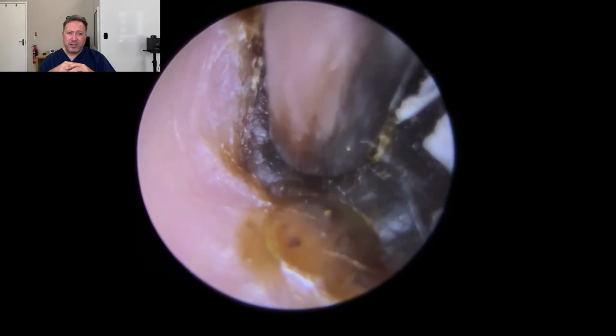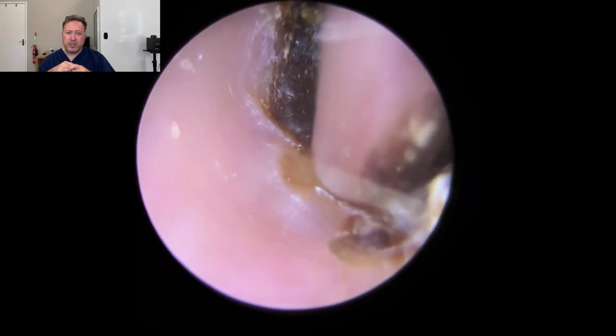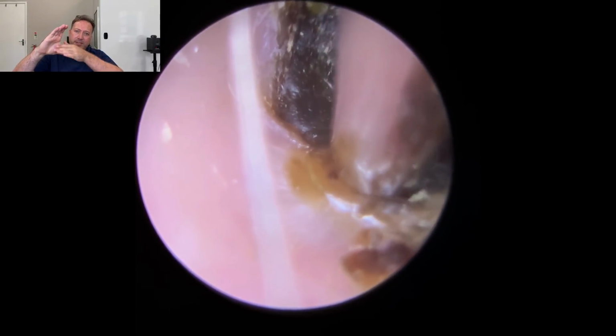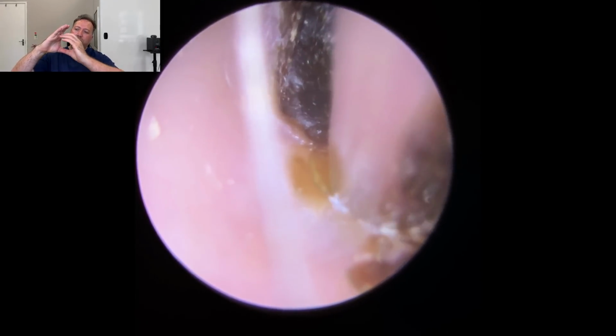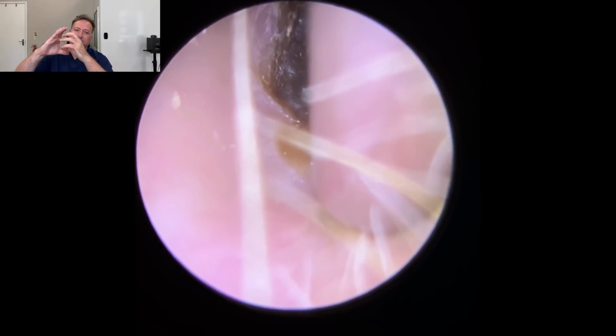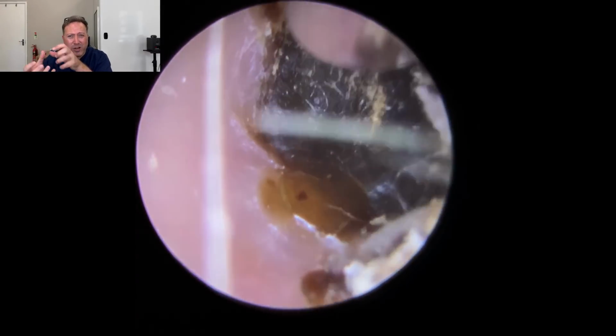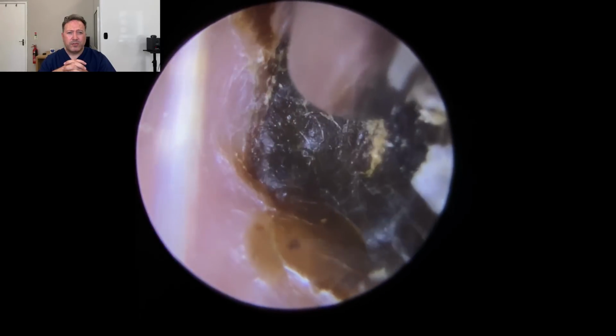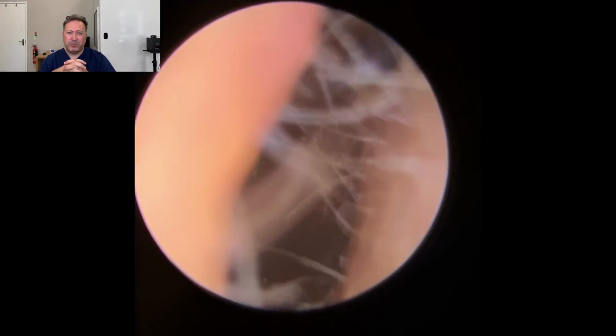And even using the standard size suction tube, which as you can see here, because of that dome, that sort of depressed section in the center here, when you're trying to get a suction grip, you can't get the grip, the air escapes through the side, so you can't get that really good kind of seal that you need to be able to get the pressure to be able to pull this through. It's a really, really difficult one to do, this one.